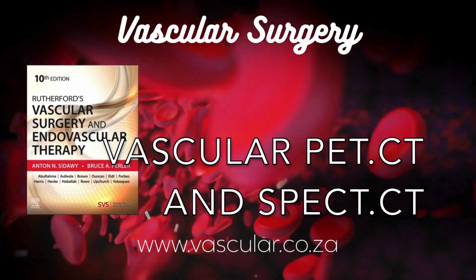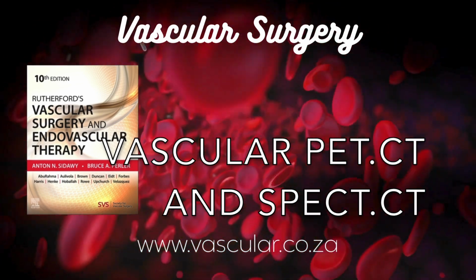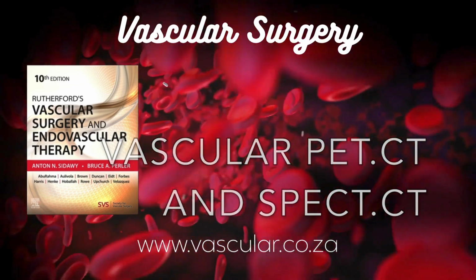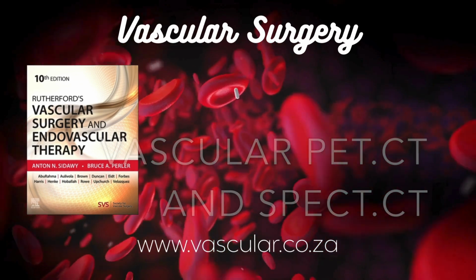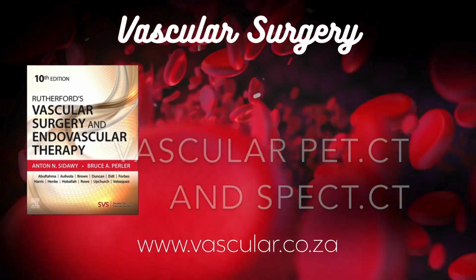You can see FDG uptake co-localizing with calcified areas on PET-CT. But the relationship isn't straightforward. Researchers have seen different patterns. Some calcified plaques show no FDG uptake. Some show both. Some show FDG uptake, but have no calcification visible on CT yet. So it's not a simple one-to-one thing?